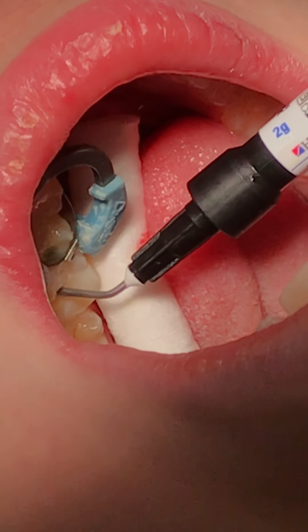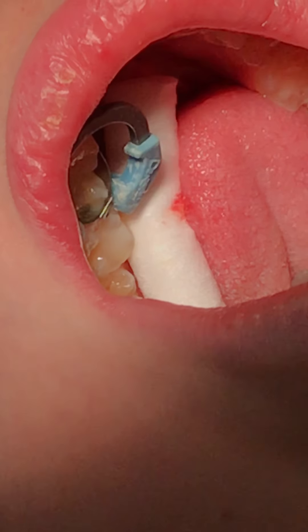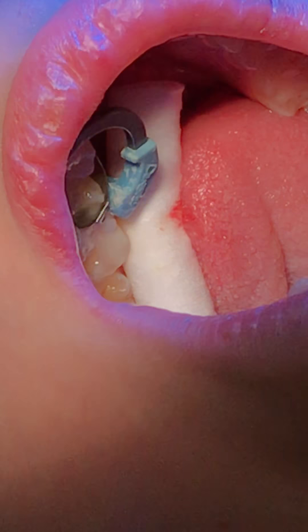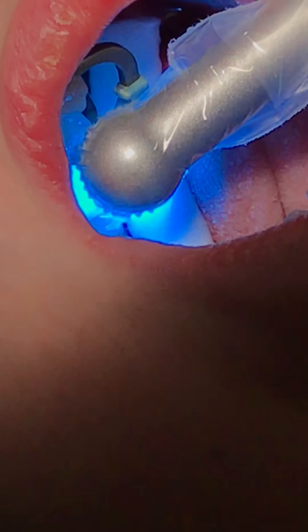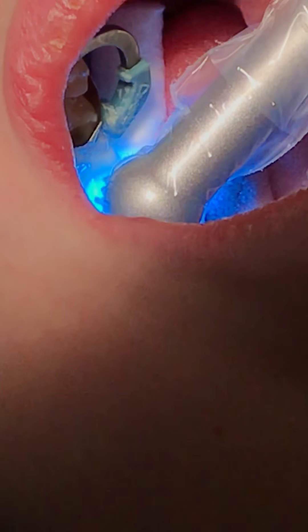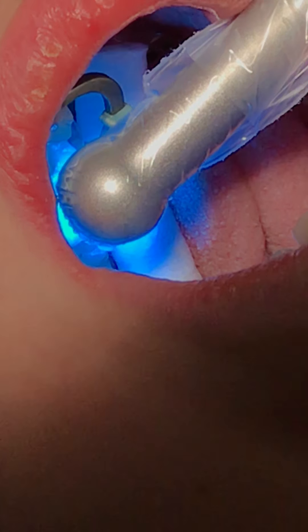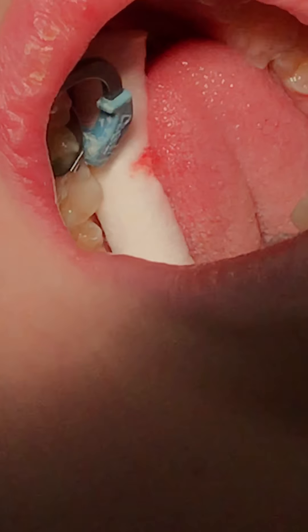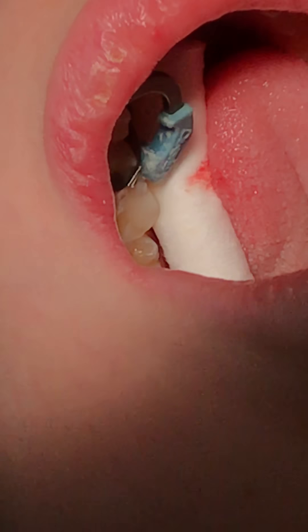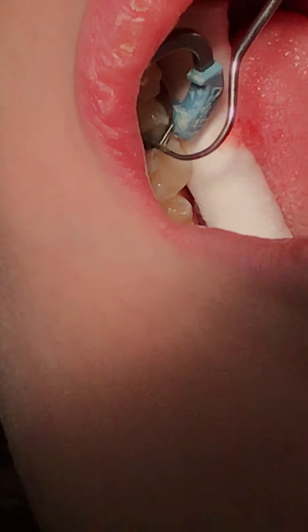Make sure I'm under these areas that are undercut — I've got the decay out. Then proceed and cure it. I don't like to put a whole bulk in there at one time because every little layer you can get optimal polymerization just by building it up gradually — there's no rush. Make sure it's nice and polymerized — looking good.